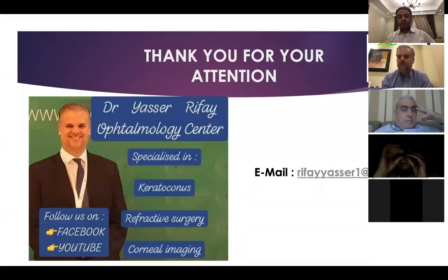If I see these three factors corresponding to each other, then we are facing something suspicious. And if this is associated with posterior elevation abnormality, then I say yes, it is keratoconus. If it is not associated with posterior elevation, I say this is something that I have to be afraid of, but it is not keratoconus.